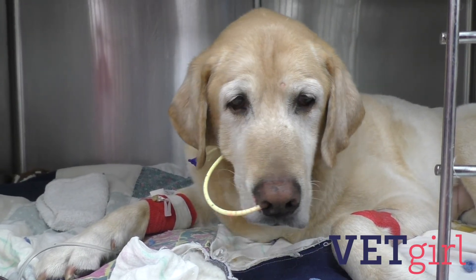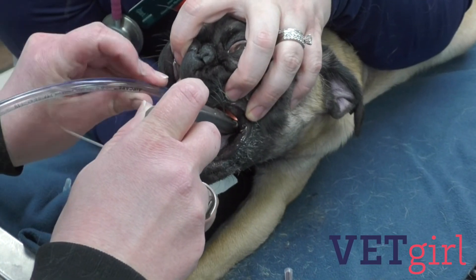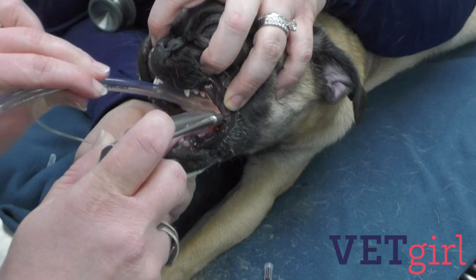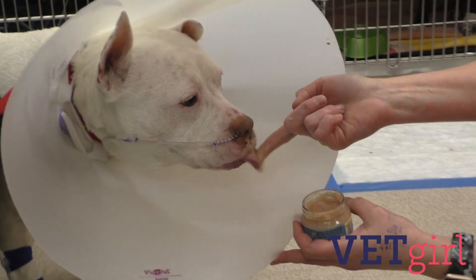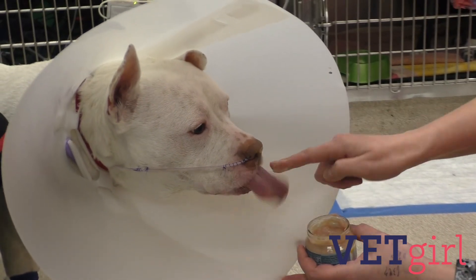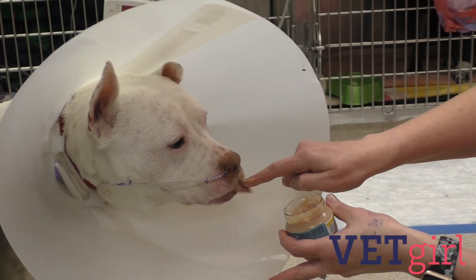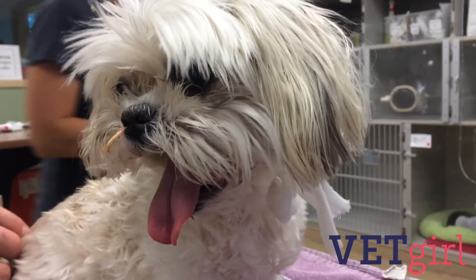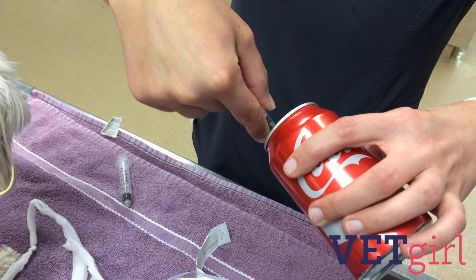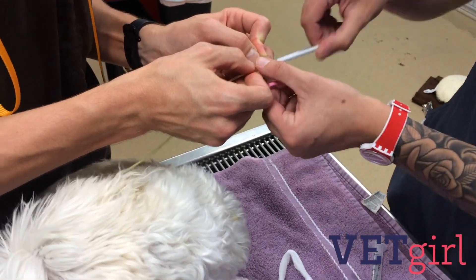A few last tips. Even if the patient is intubated, you need to verify that the tube is in the esophagus, as an endotracheal tube will not fully occlude the tube from entering the trachea. It's a common misconception that patients can't eat with an NG tube in place — they can. Continue to offer food, and once the patient is eating well, go ahead and remove the tube. Oral medications should ideally be avoided through the tube as it will increase the risk of the tube getting plugged up. If it plugs up, try flushing some soda down the line to unclog it.